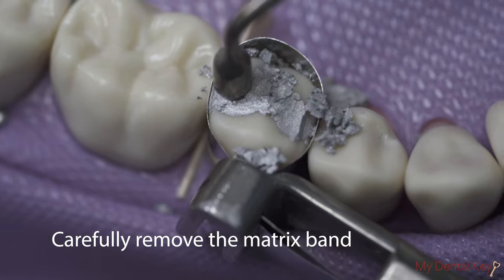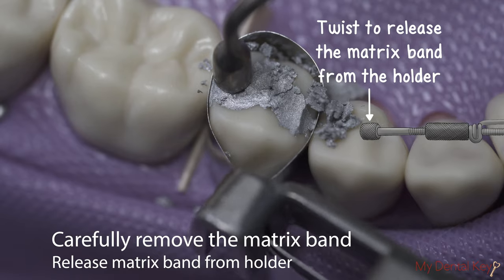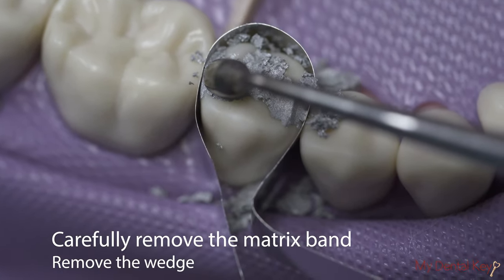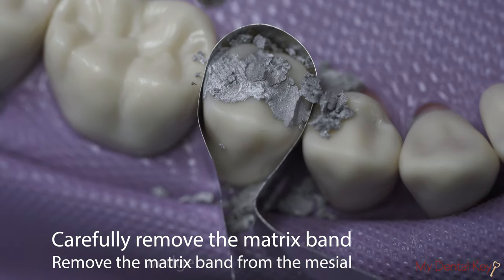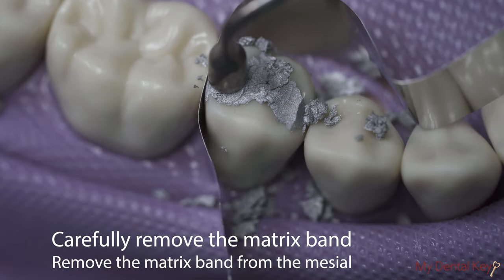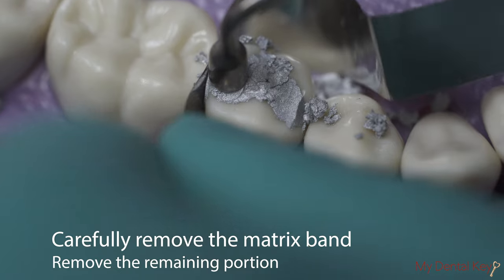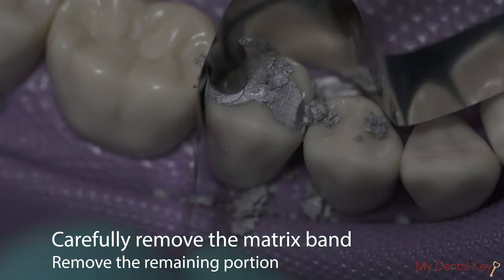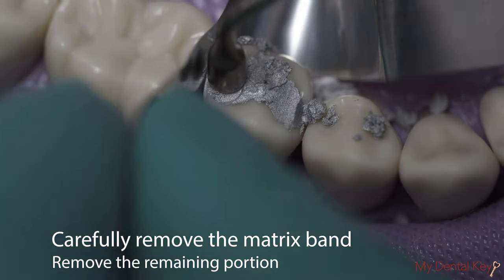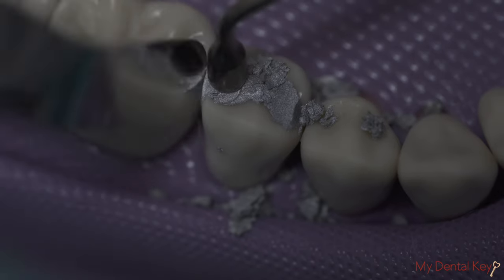Now, carefully remove the matrix band. The first step is to loosen the short swivel to release the matrix band from the matrix band holder. Then, remove the interproximal wedge with forceps, and then remove the matrix band from the opposite side of the proximal box. Lightly hold down the amalgam with an instrument, and carefully remove the remaining portion of the matrix band in the buccal occlusal or lingual occlusal direction. Be careful — removing the matrix band in the occlusal direction may dislodge the restoration.